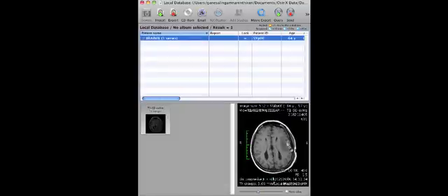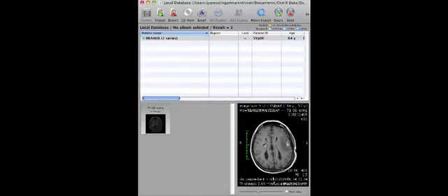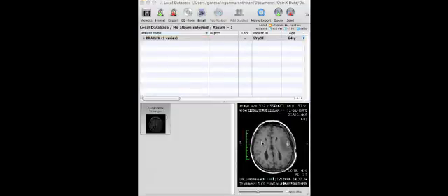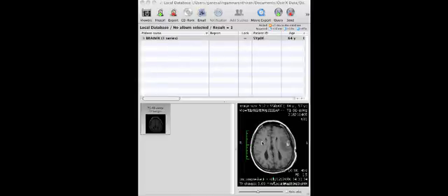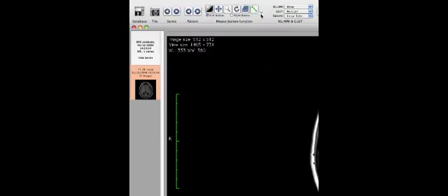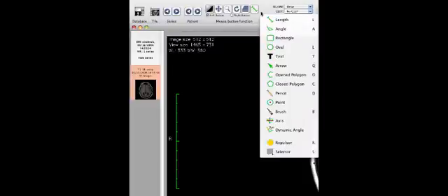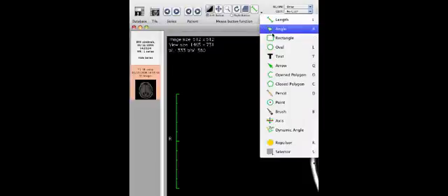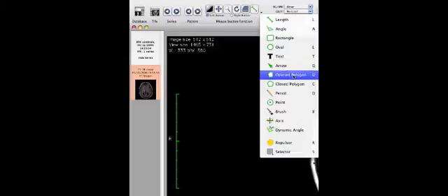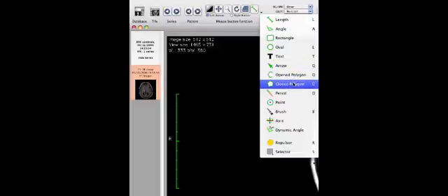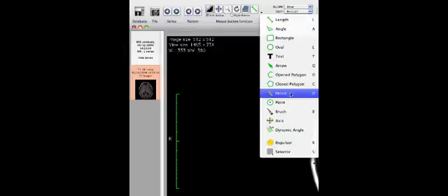The next step you need to do is to double click on the image. That's going to bring you up this window on which you are going to do most of your segmentation, 3D visualization and so on. Let's go to the toolbar and click on this drop down menu. You can use the open polygon and I actually prefer pencil. So I am going to click on pencil now.